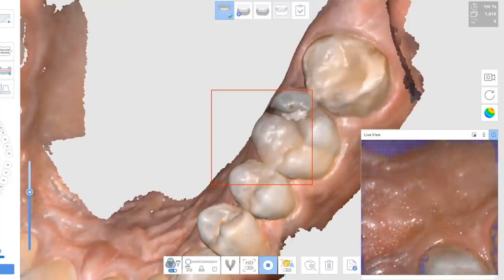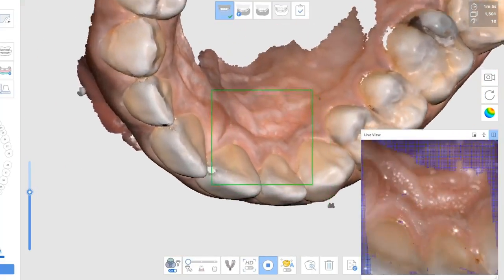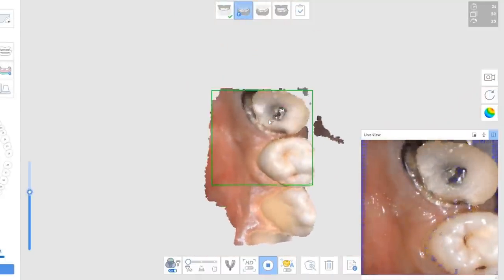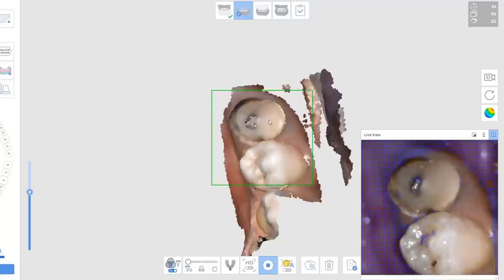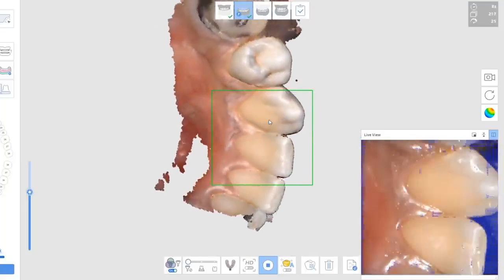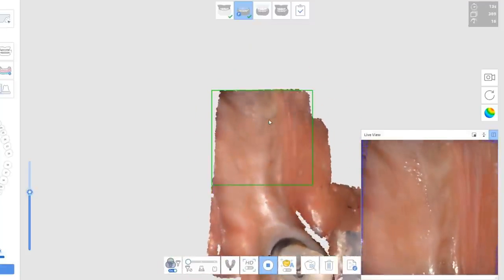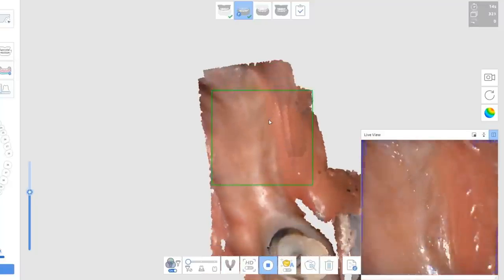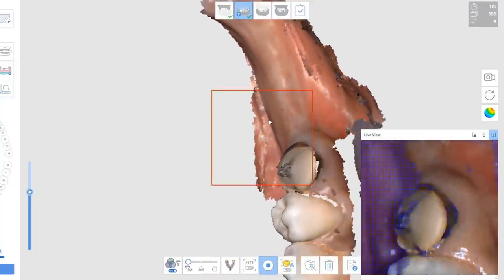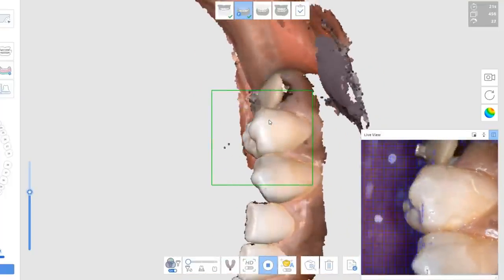So very important that you understand that. I used my finger, the blue glove, and I imaged enough for the software to recognize that that second molar, that extra cheek tissue that I picked up inadvertently, was not part of the equation. I do the same thing on the lower. We've got this edentulous area, and I'm controlling the lip movement, the tongue movement. All of that can be distraction. And I'm using the filters and my fingers to guide this area.